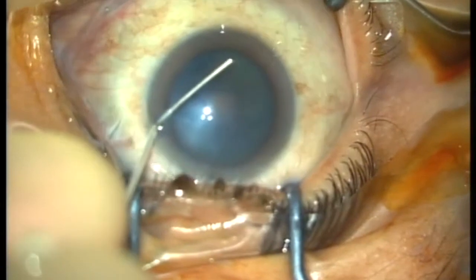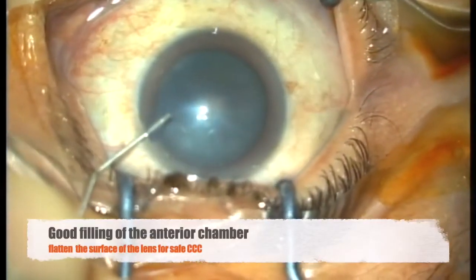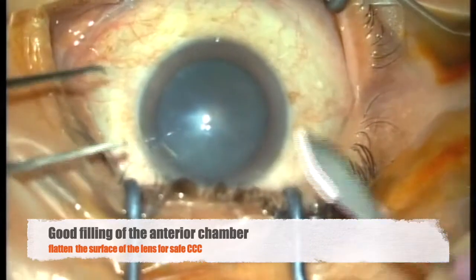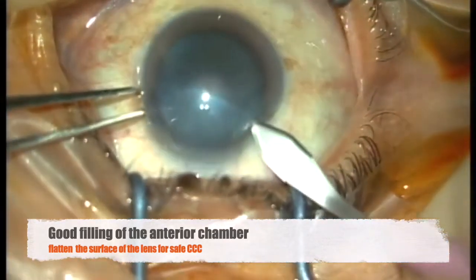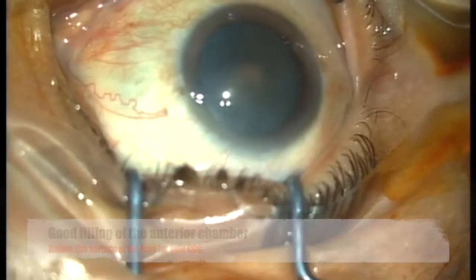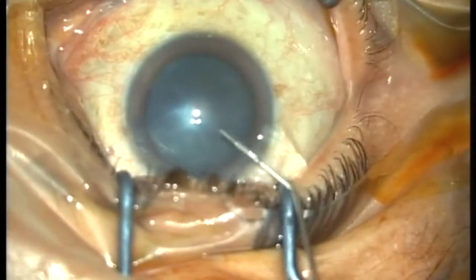This is followed by injecting viscoelastic into the anterior chamber inside out. Pay attention at the moment we create the main wound. We can see there is an indentation during the wound creation, which denotes potentially underfilling of the anterior chamber. In this case, good filling is needed to flatten the bulge of the lens for a safe capsulorhexis.